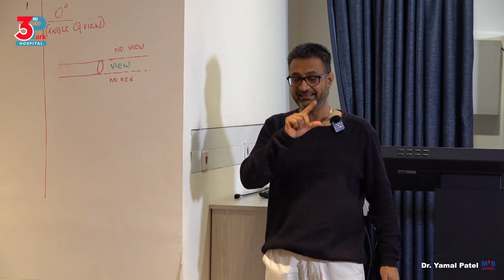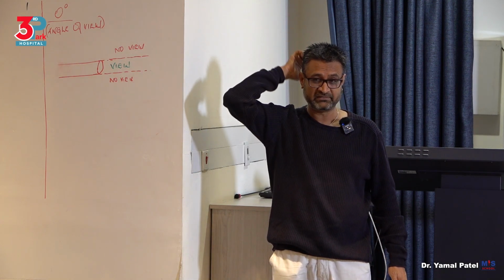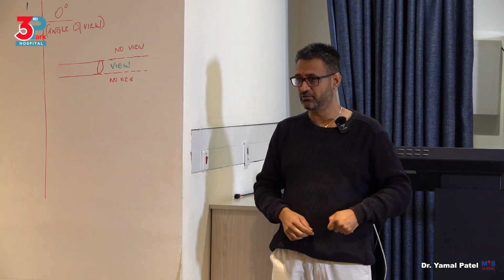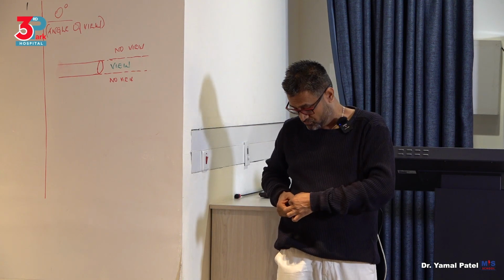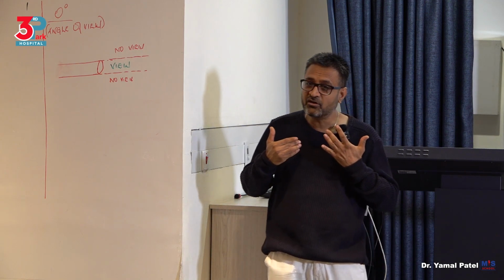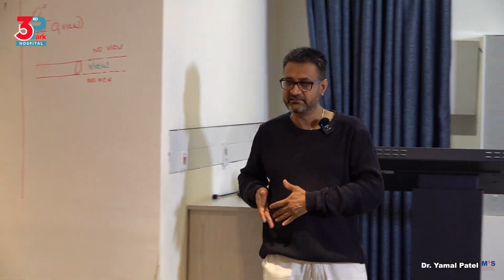That's what happens in our surgery when we use the monopolar pencil. You burn here, and here it's returning. You're not reducing how much energy is here and how much is there. What you have done is small surface area, big surface area. This does not burn, this burns.